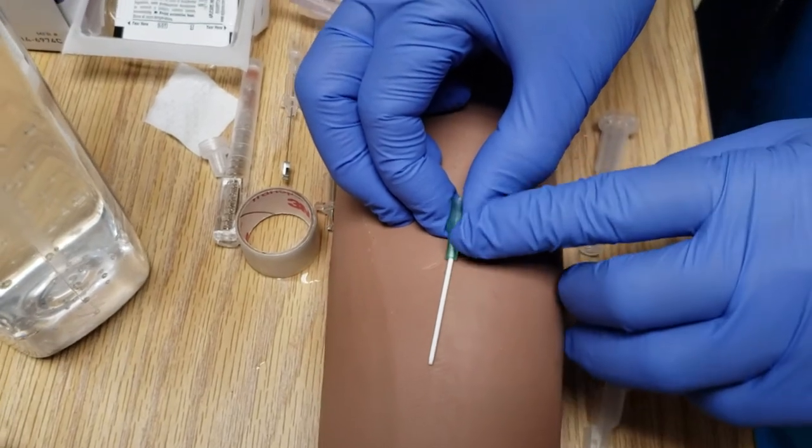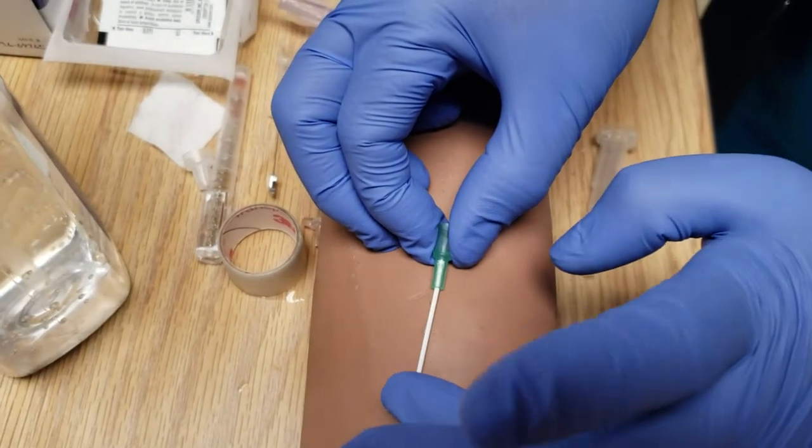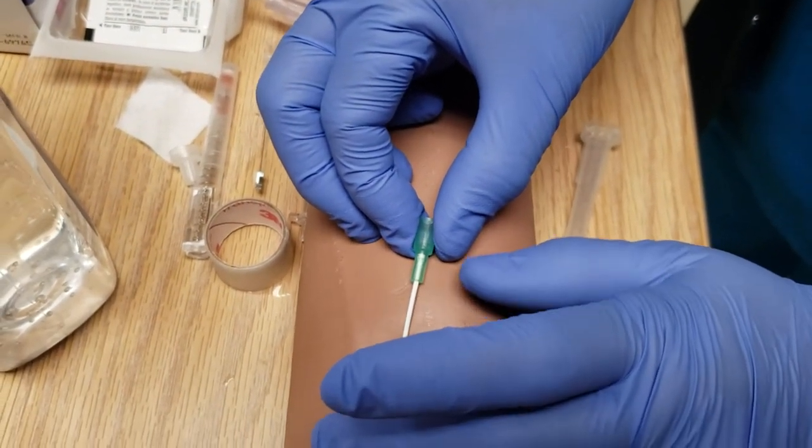What you want to do is put your finger, this finger, at where the tip would be. You want to occlude that. This prevents the blood from backing up into your catheter.